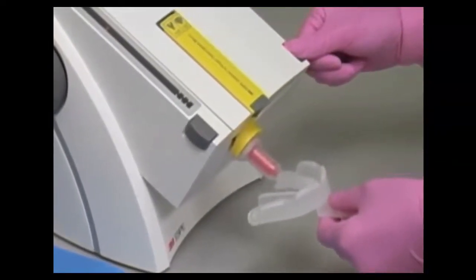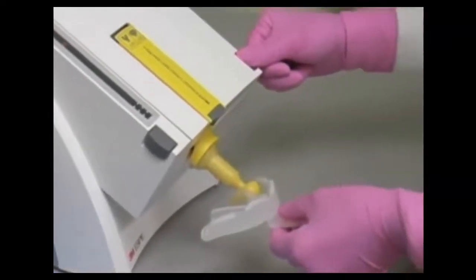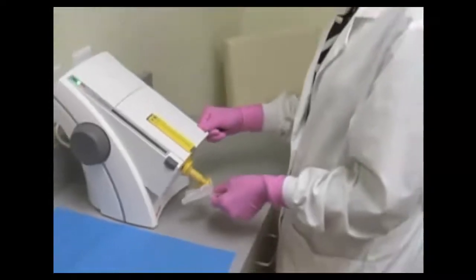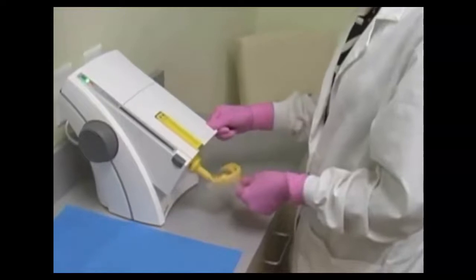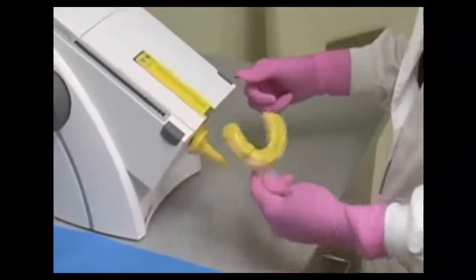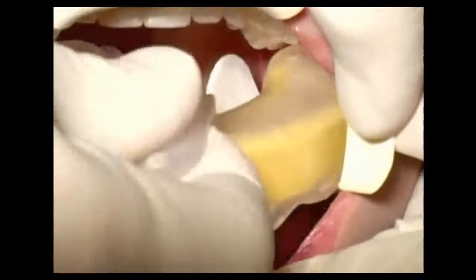Here she's using a full arch tray for the lower with the heavy bodied material. She's loading the tray, which will be used to take the final impression. So this is done in a two-step. You could use the impression that was taken before to also do that and make the temporary.